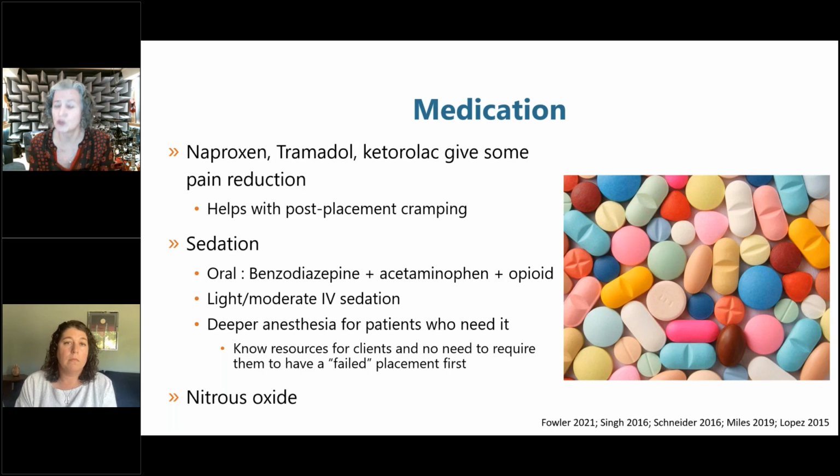The other thing that's super important about topical anesthetic is that the lower part of the vagina can experience it as burning. It's acidic. When you spray lidocaine into the vagina and the entire vagina is coated in it, people can experience that as stinging, particularly if they have any kind of irritation or inflammation in their vagina whatsoever.